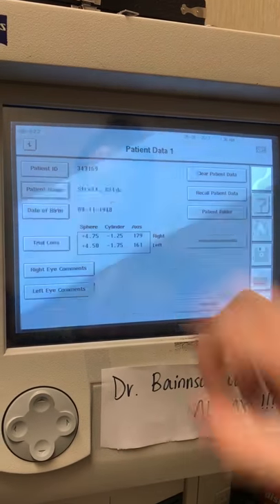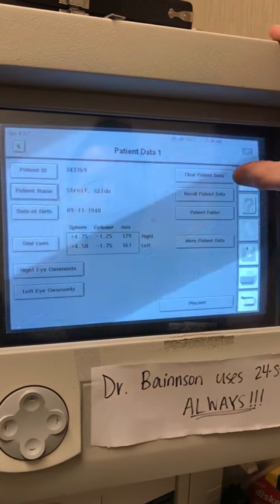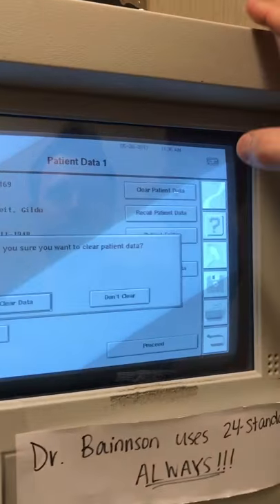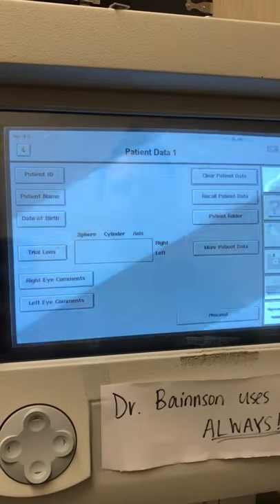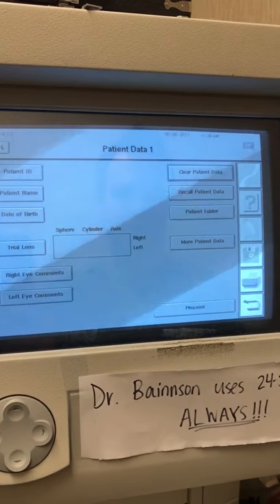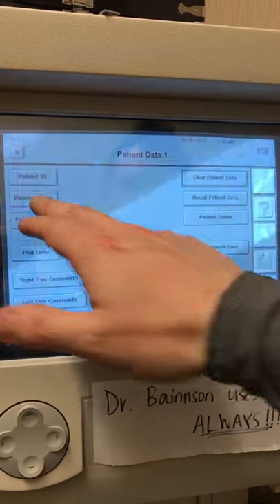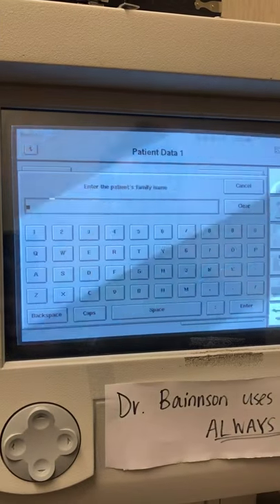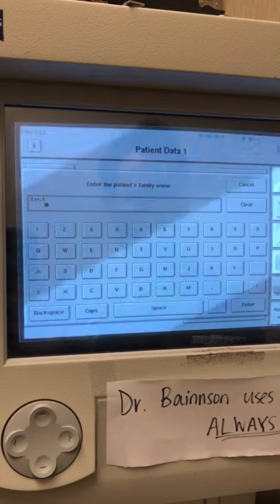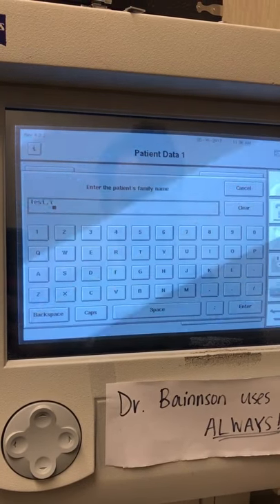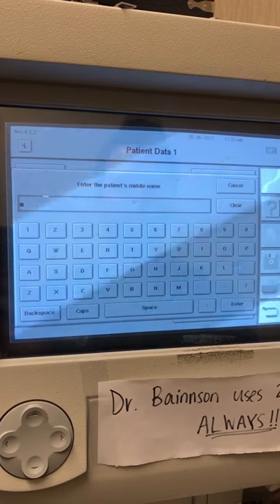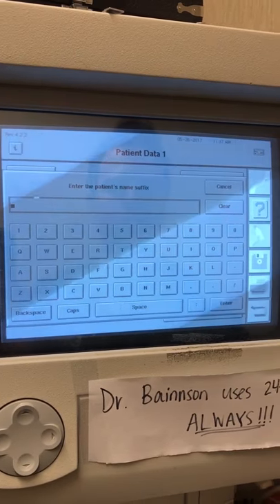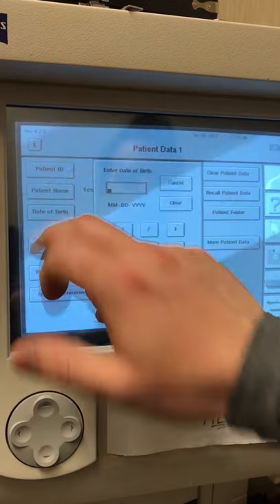We'll select the right eye first, and then we're going to clear the patient data out of there and enter a new patient's ID information. We'll just enter the patient's name and information in here, including their date of birth.